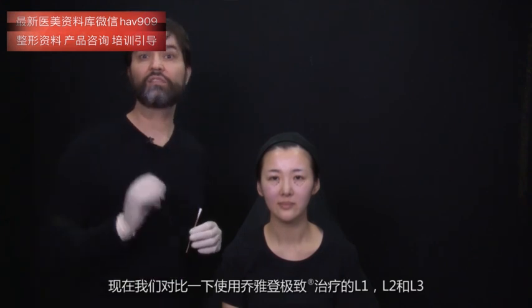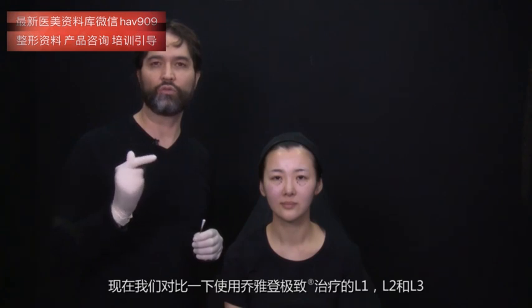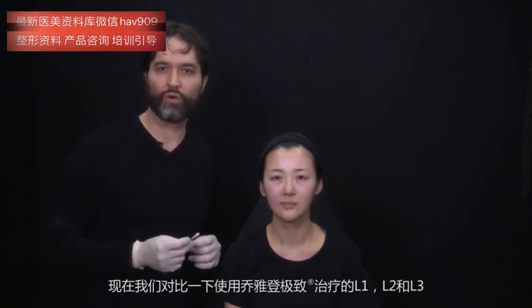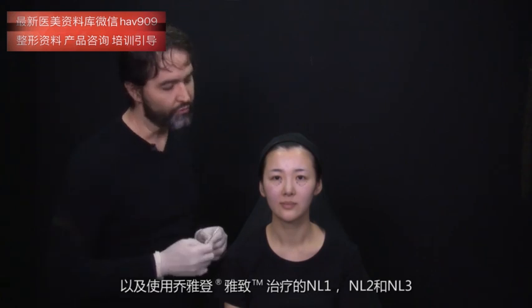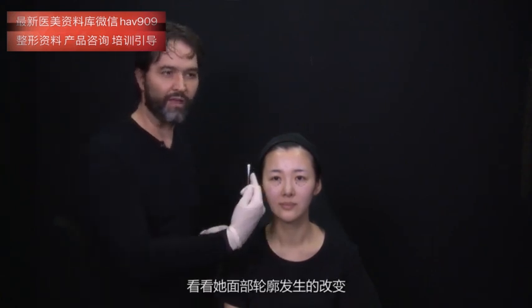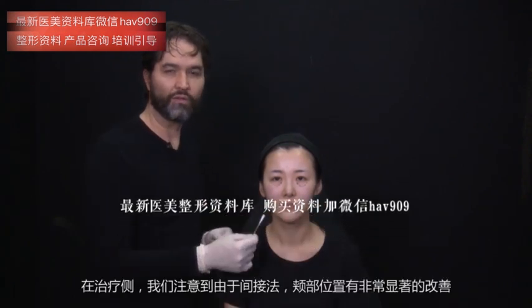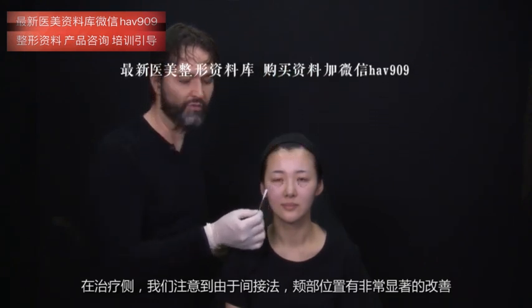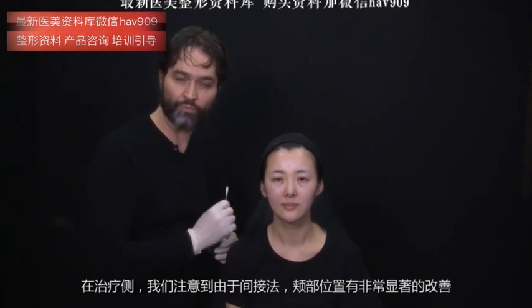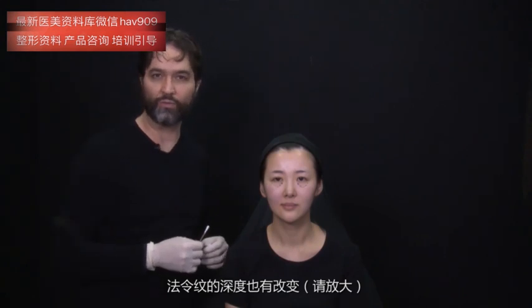Now, let's check the treatment of L1, L2, L3 with Juvederm Ultra Plus and NL1, NL2, and NL3 with Juvederm Ultra. Take a look at what has happened in her facial shape. On the treated side, we notice a very much improvement of the position of the cheek because of the indirect approach, and also the change at the level of the nasolabial folds.